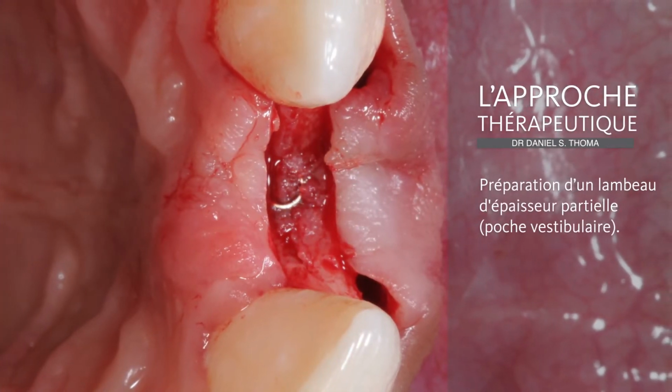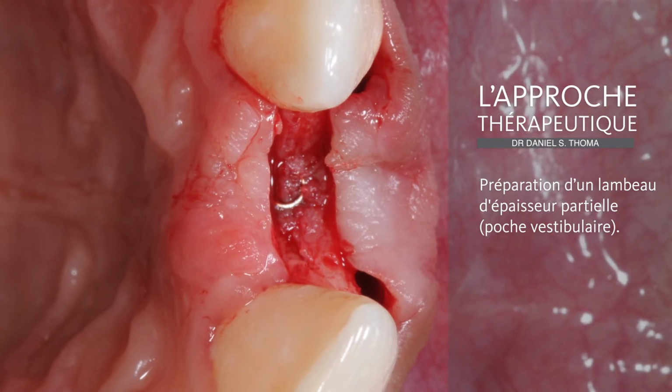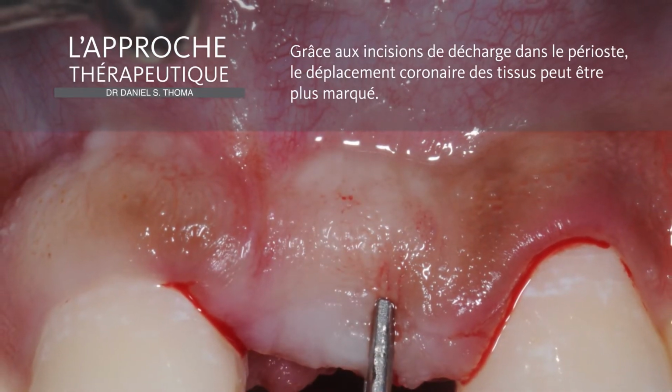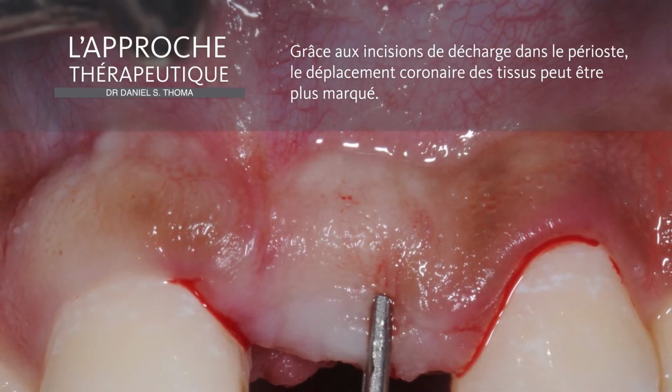As a first step to perform the soft tissue grafting procedure, a split thickness flap is prepared crestally on top of the implant, but also on the buccal side. Following the preparation of the split thickness flap, we can see, and also due to the releasing incision in the periosteum, we are able to advance the flap more coronally.